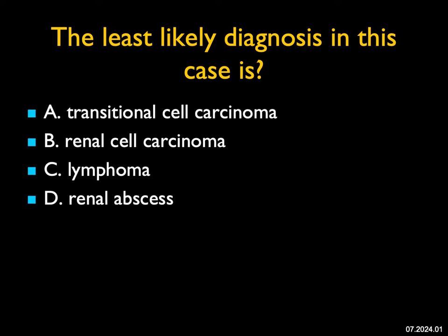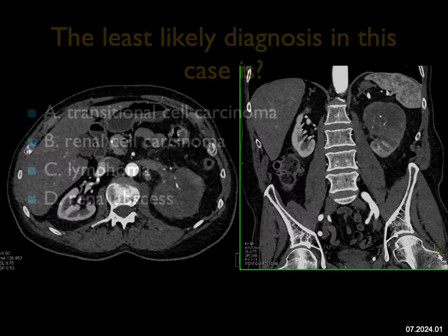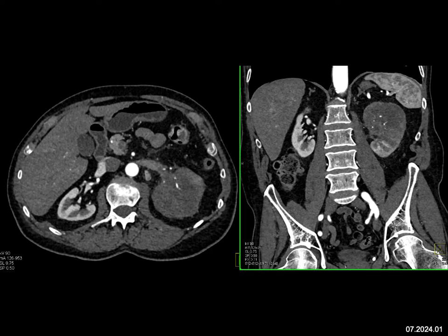The least likely diagnosis in this case — well, what do I see? On the axial and coronal views, there's an infiltrating process involving the upper two-thirds of the left kidney. This is arterial phase imaging, but this lesion is not vascular. It's probably best defined as infiltrative.